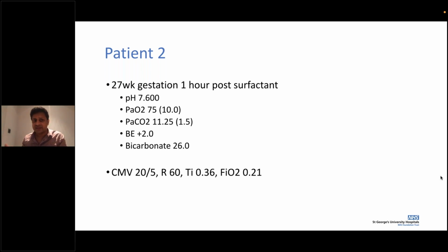supported, and if there is enough trigger, my type of plan would be volume control on a patient trigger mode of ventilation. And then ensure that the rate is right down, because it can be as low as 40, and every breath beyond that will still be supported if you're on a PTV mode of ventilation.